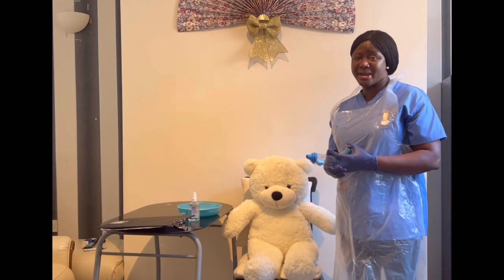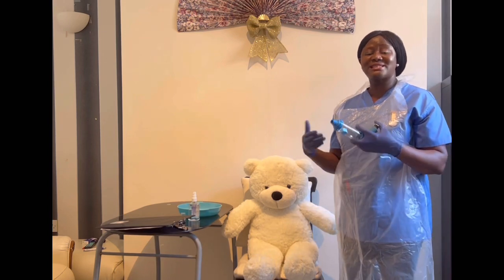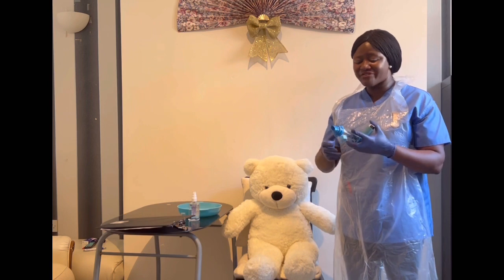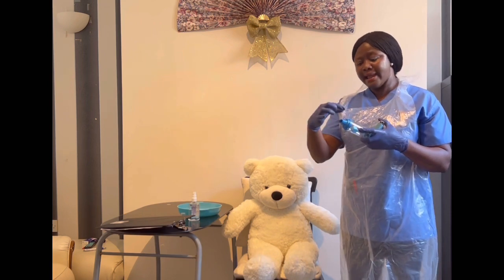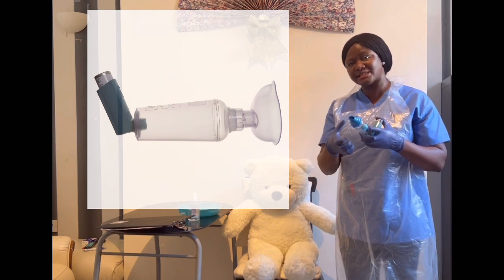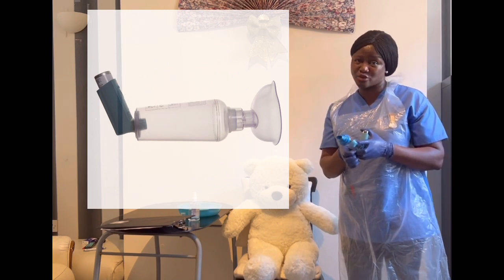But of course, I'll just explain. We have another method, which is called the tidal breathing method or technique. You have a different covering mouthpiece, in the form of a mask with a spacer device as well.